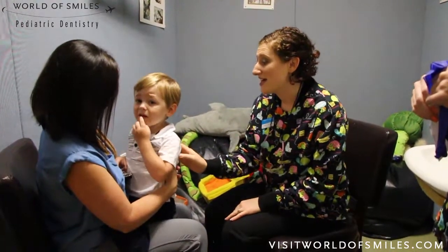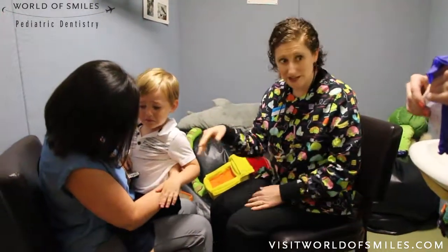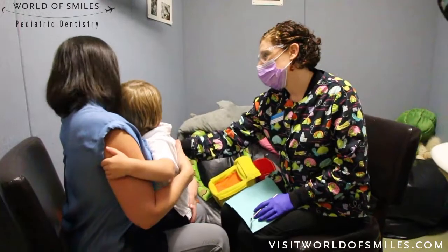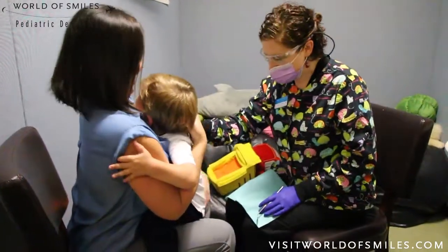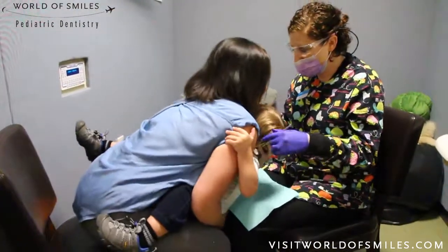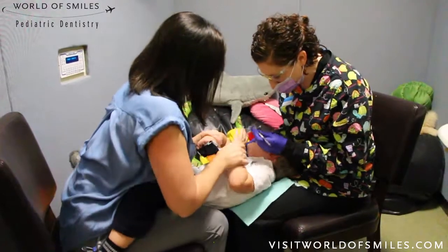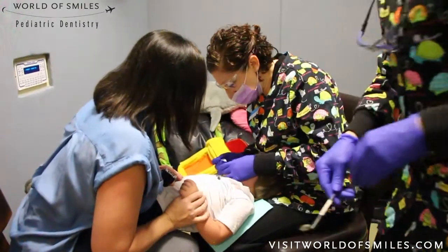We're going to take down the audio so I can talk you through this process. Since our little guy is having a bit of a hard time, it's okay to do a lap-to-lap exam for this. Make sure that the parent is holding the hands tightly and keeping the legs down as well.